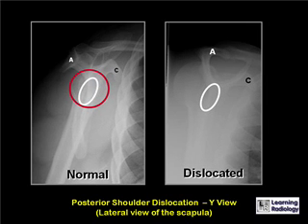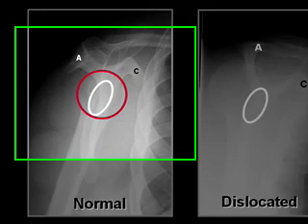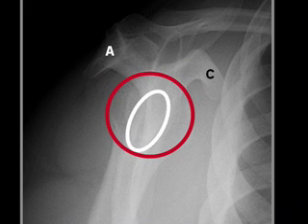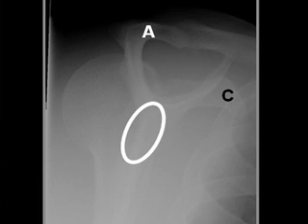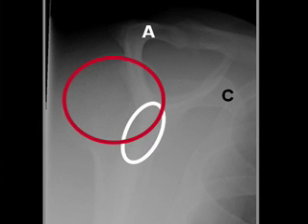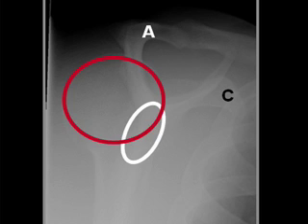This is what the Y view — the lateral view of the scapula — looks like in an individual with a posterior shoulder dislocation. First, the normal view shows the humeral head, marked by the red circle, centered on the glenoid. In the individual with a posterior dislocation, the humeral head lies outside of the glenoid, underneath the acromion process — not the coracoid, as in an anterior dislocation.